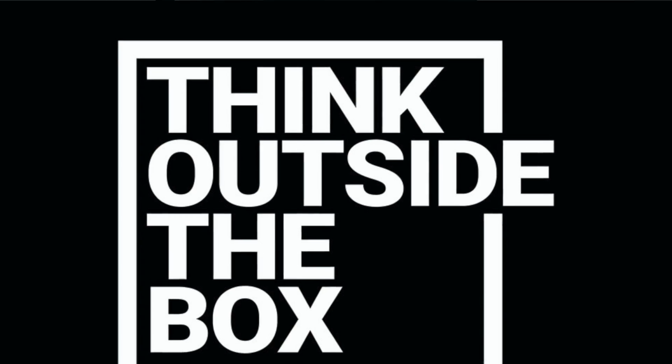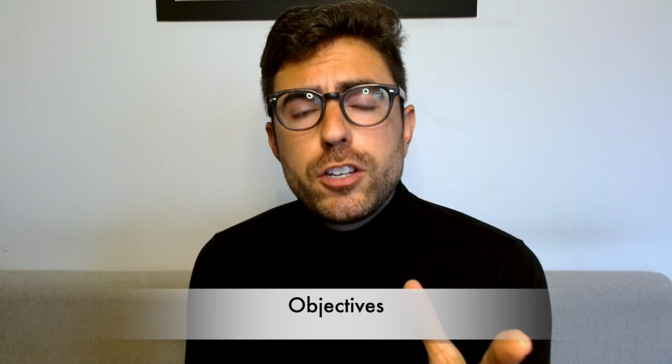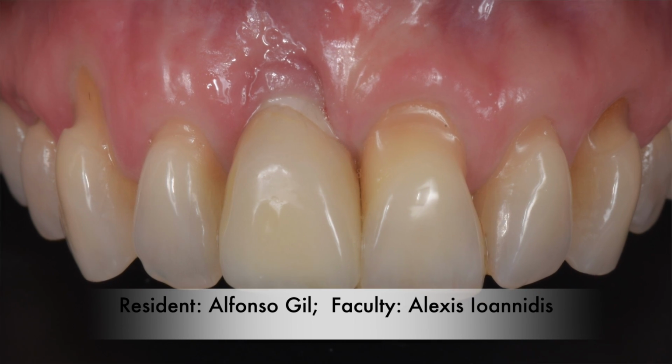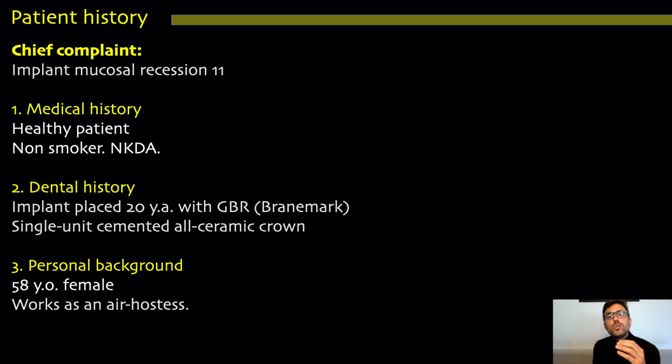The reason why you should watch this video is because together we will think outside the box and resolve, in a very unconventional manner, a complex and esthetic implant recession case. The aim of this presentation is to show you the coverage of this peri-implant mucosal recession with the VISTA technique, walk you through the clinical steps of the procedure, and finally show you the outcomes.